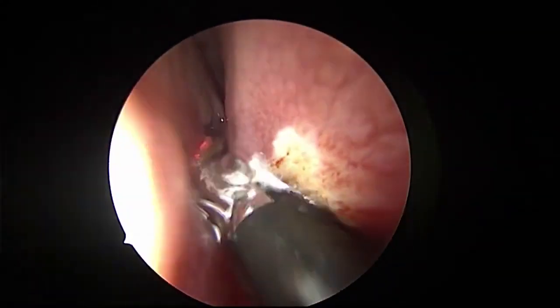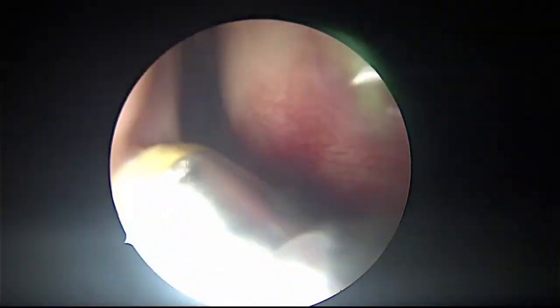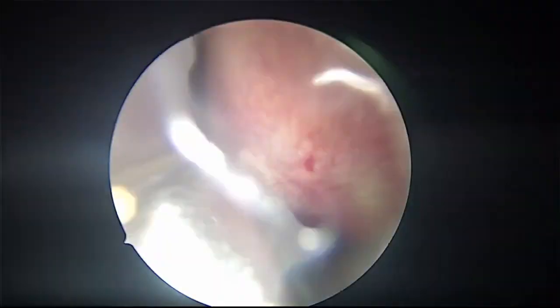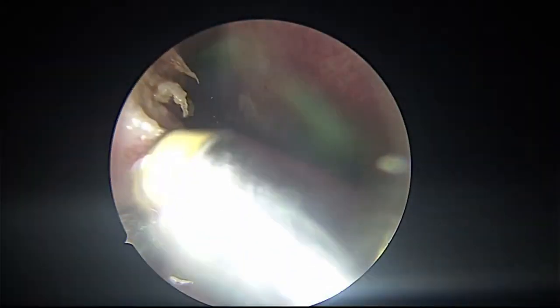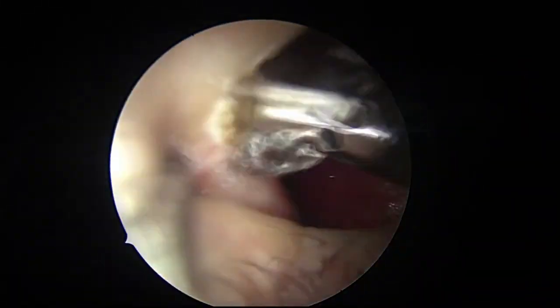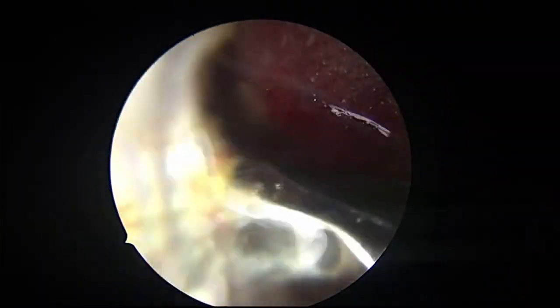So I am removing this mucoperiosteum, say a centimeter below the axilla, defining the level of the floor of the orbit, and coming anteriorly till the pyriform aperture. I'll see the pyriform aperture.